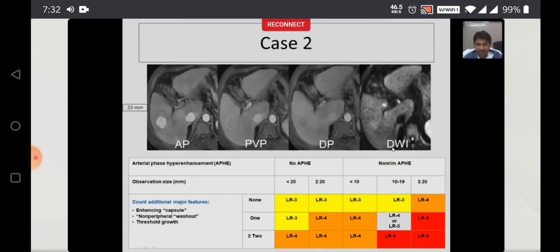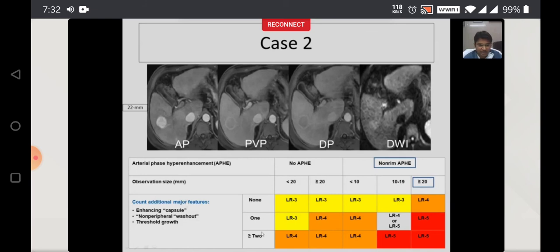Another case: looking carefully at the different phases, this is a 22mm size observation in the liver parenchyma showing non-rim arterial phase hyperenhancement. Size is more than 20mm, so it falls into that cell. It shows washout and a capsule — at least two major features. So it falls into LIRADS 5. Another example: a lesion almost more than 2cm with non-rim arterial phase hyperenhancement, capsule, and washout — again LIRADS 5.